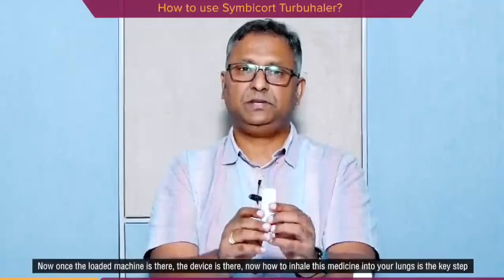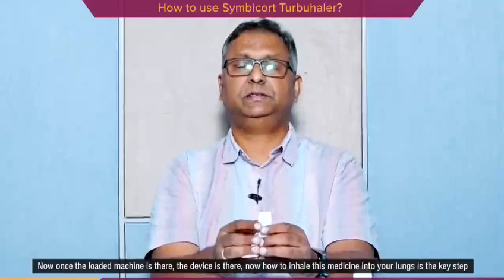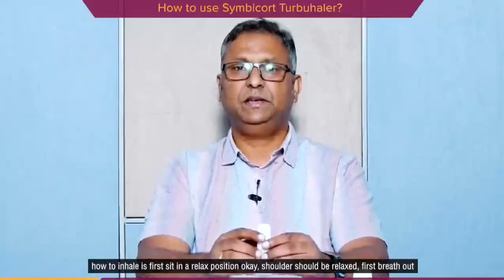Now once the device is loaded, how to inhale this medicine into your lungs is the key step. To inhale, first sit in a relaxed position. Okay, shoulders should be relaxed. First, breathe out.